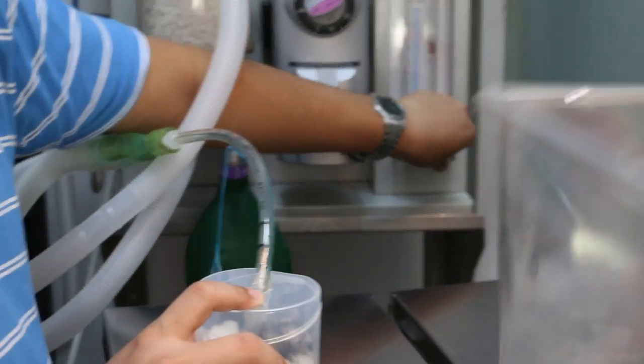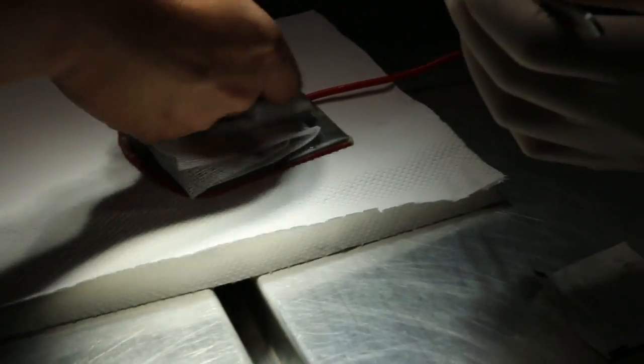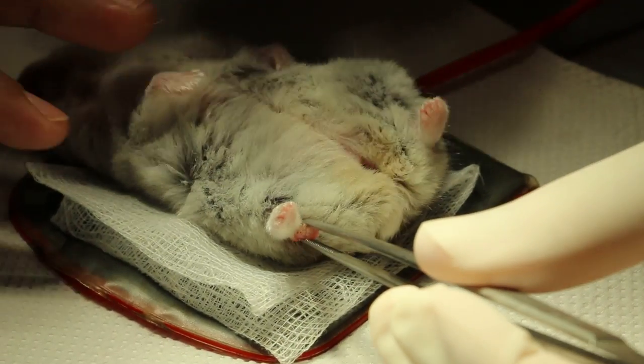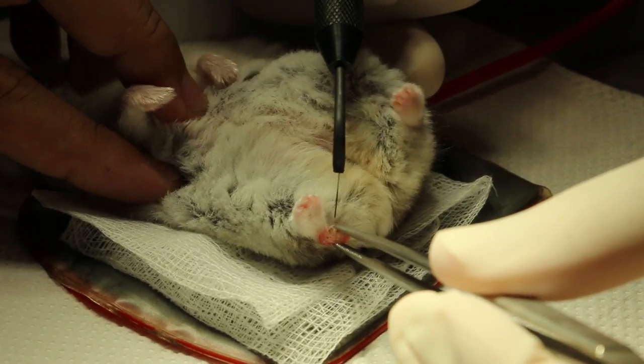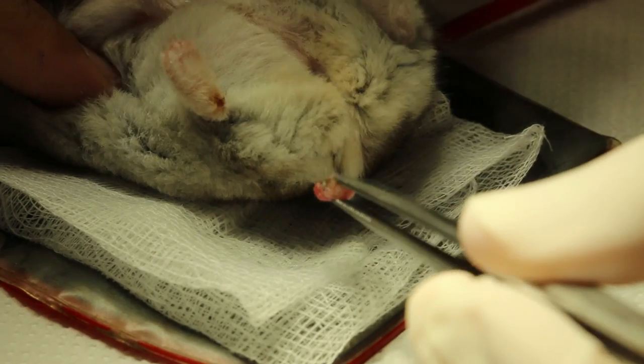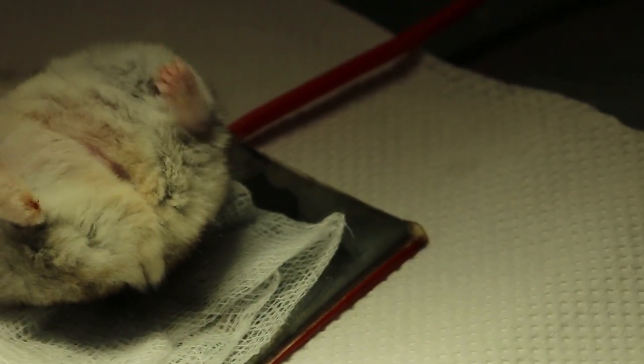How many number oxygen flow? 4. Okay. This away first. A bit further away so that I do not overexpose. Yeah. Okay. Assistant holds it. Hold the toe. Don't touch the table. Okay, put down first, then the other leg.